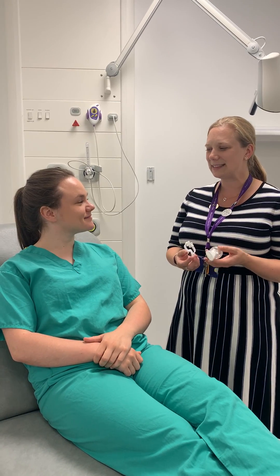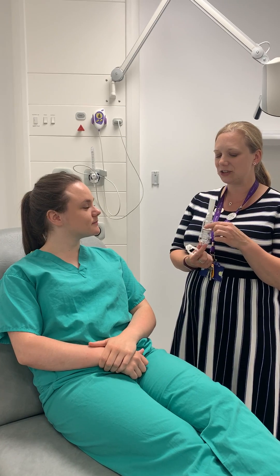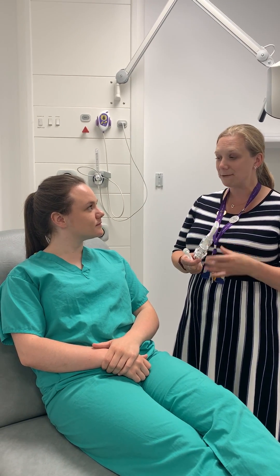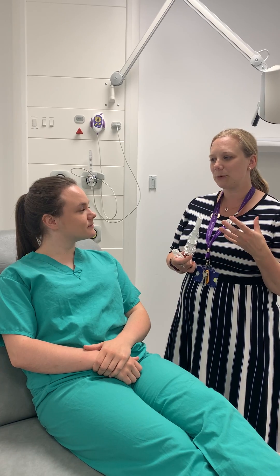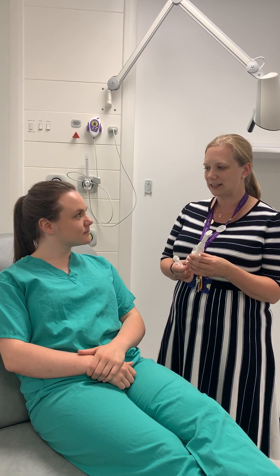Good afternoon Chloe, my name is Stephanie, I'm one of the physios and this afternoon I'm going to teach you how to use the Inspiratory Muscle Trainer. This is like weight training for your breathing muscles. By making your breathing muscles stronger, they will use less oxygen and it should make you feel less breathless as a result. So that's the idea.